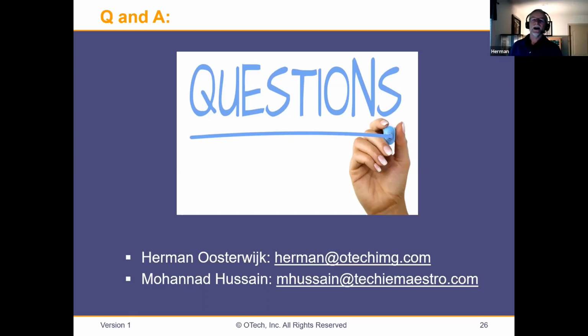Yeah, so ask for the conformance statement, and then ask for the right people to give you the conformance statement with the right version and the right implementation class UID. You can double check. So yeah, sometimes dealing with vendors could be a little bit challenging, but the good news is now we can refer them to a SIIM webcast about DICOMweb if they want to learn more. That's it for us, Bradley.